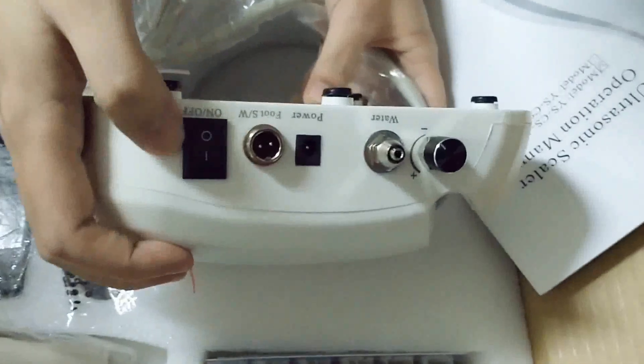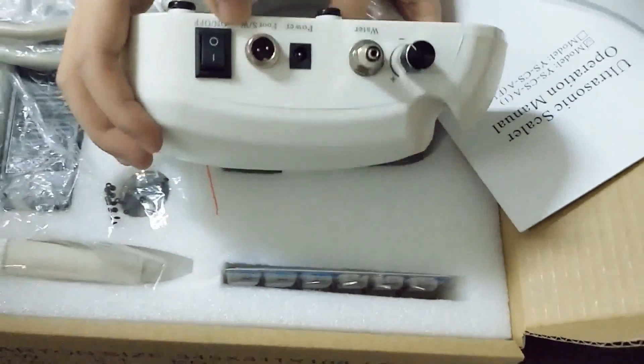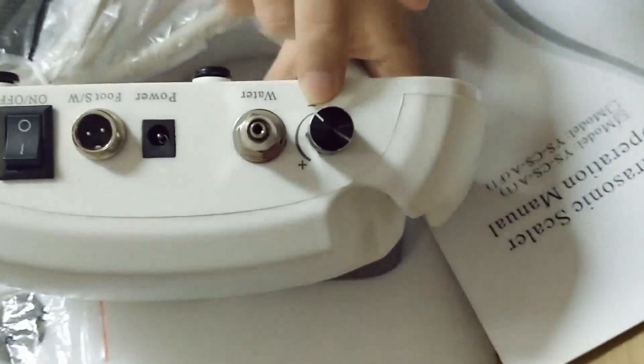Please look at the back side. This is the power button, and here is the foot switch access. This is the water intake, and this is for working regulation.